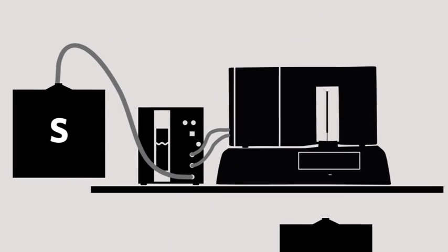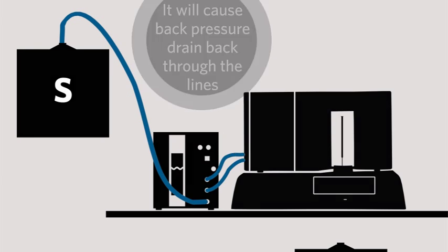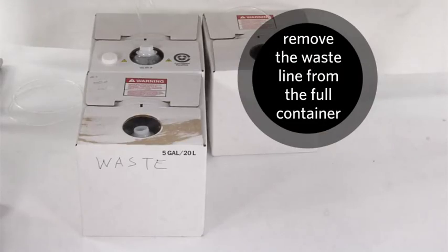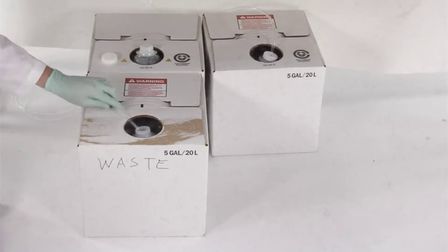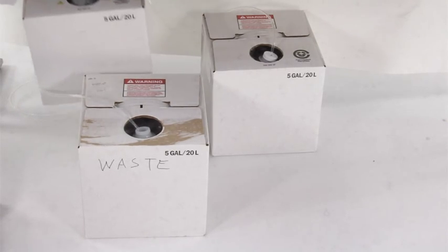Lifting the container above the instrument will cause back pressure inside the SD and force fluid to drain back through the air lines and into the instrument. If the waste fluid container is full, remove the waste fluid line from the full container and place it in an empty sheath fluid container. Discard the full container by appropriate means.